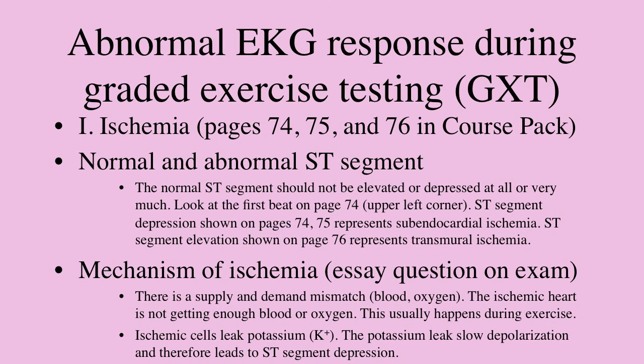So just to look at reading the statement, the normal ST segment should not be elevated or depressed very much. And if you look at page 74, the first beat in the upper left corner, there's hardly any ST segment depression. It's pretty much at baseline. But if you follow that EKG during exercise, going from left to right, these are actually composite beats where the machine has taken every 2 minutes and composited this into a beat, made one beat out of it.